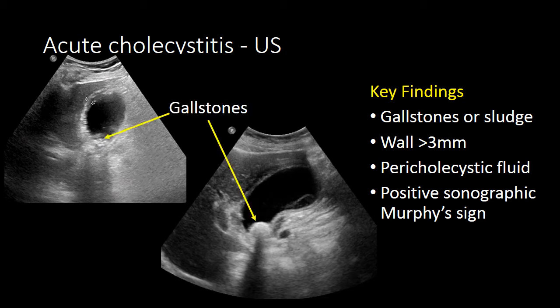In these cases, we see gallstones in the neck of the gallbladder. We can also see gallbladder wall thickening, indicating an inflamed gallbladder wall and acute cholecystitis. These patients also had a positive sonographic Murphy sign, further confirming the diagnosis.